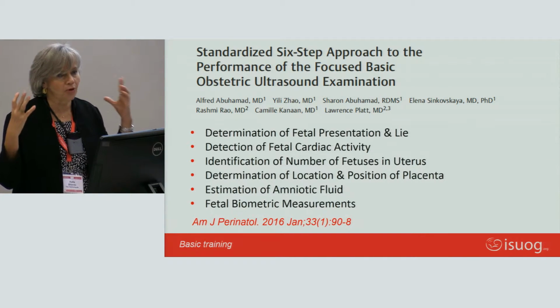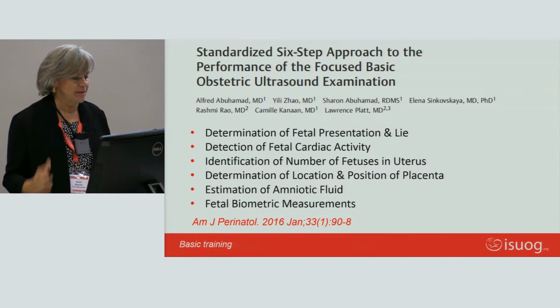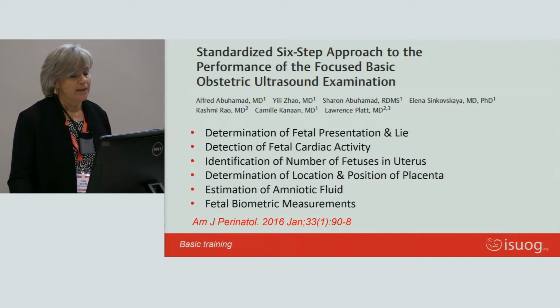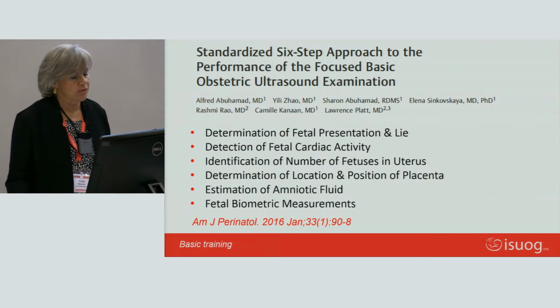He has thought very carefully about which are the important movements and which is the important information, and he has put this down in this 6-step approach, which at the end will tell you how the fetus is lying, if the fetus is alive, if there is cardiac activity, if there is one fetus or more, and will also give you some information on the position of the placenta and the volume of the amniotic fluid.